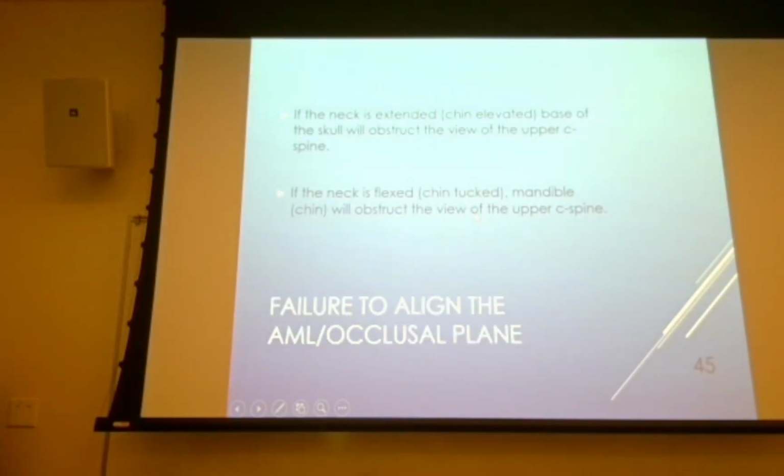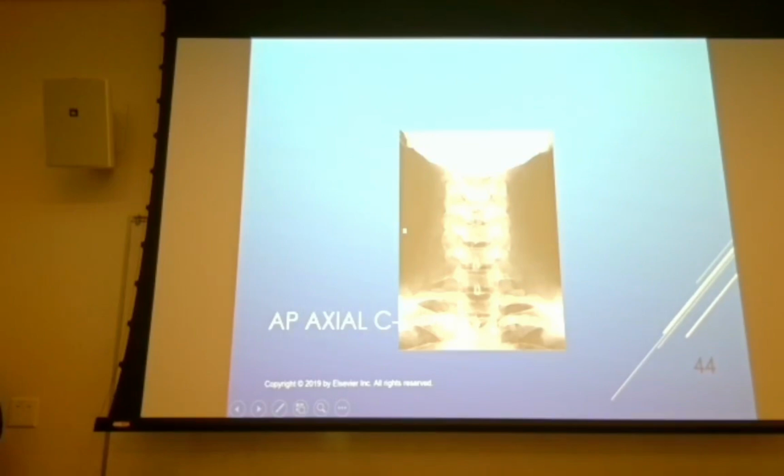So with collimation, it needs to be like 10 inches long, right? Yeah, I would go with 12. So what you want to see is as high up on the C-spine as possible, and then you need to get all the way down to T2. Minimum T1, but you really want to get to T2. So I'd go with to the skin line, 12 inches. Yeah.